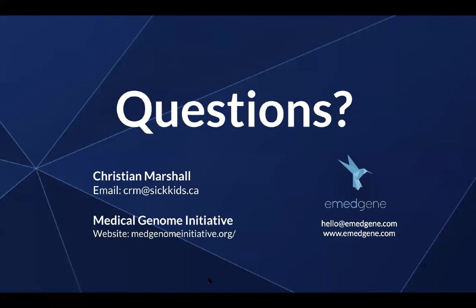Great. Could you comment on the clinical utility of RNA sequencing in rare disease diagnosis? Yeah, that's a great question. It's something that we're working on in parallel here. It is setting up more of a clinical RNA sequencing pipeline. My personal opinion is that it works really, really well in some cases, and in others, I wouldn't use it as a first-line test. But as we move much more into genomes, I think it becomes more and more useful. And part of that is because of trying to interpret a lot of the non-coding variation and what it actually means.